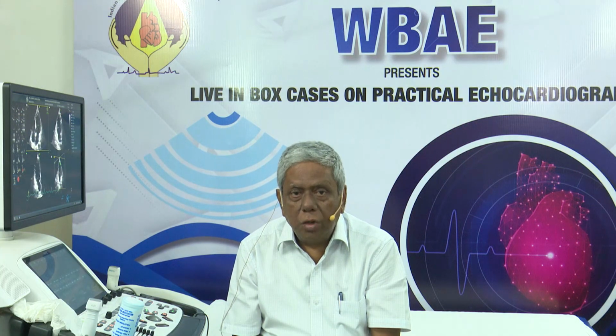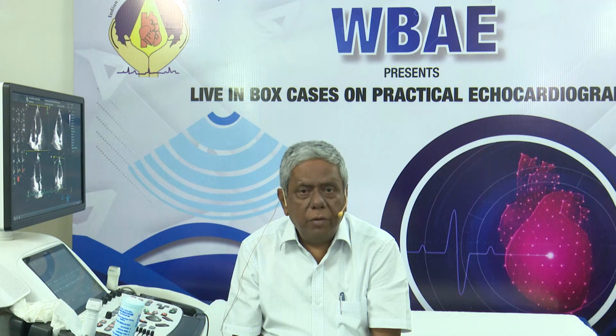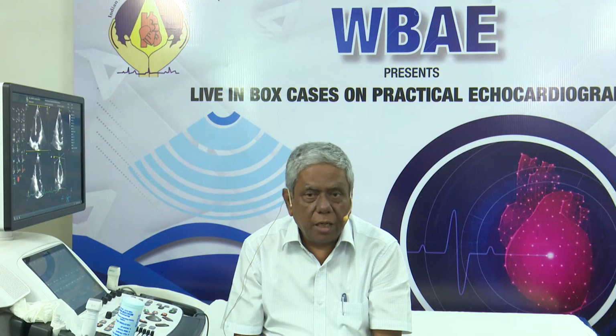I would discuss two cases here today, based mostly on right ventricular quantification, pulmonary hypertension assessment, as well as quantification of tricuspid regurgitation. Let's begin with case number 1.